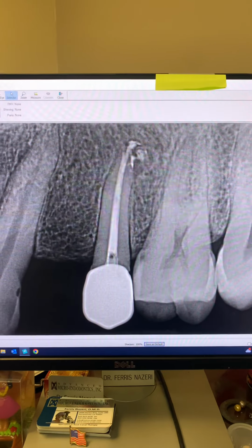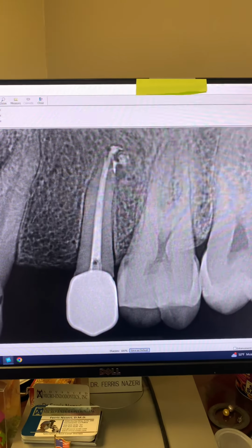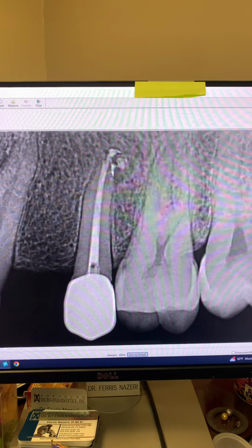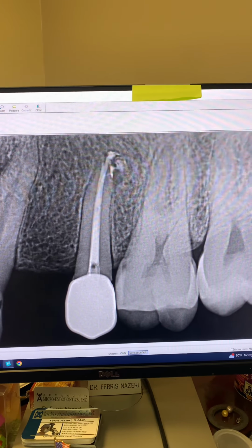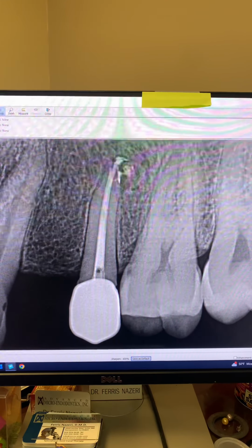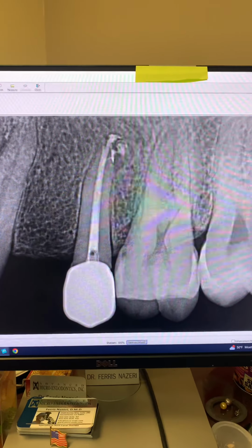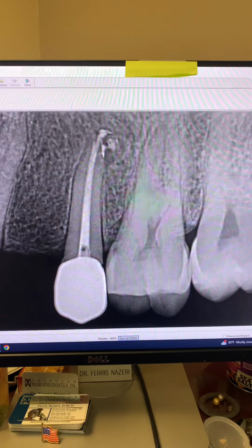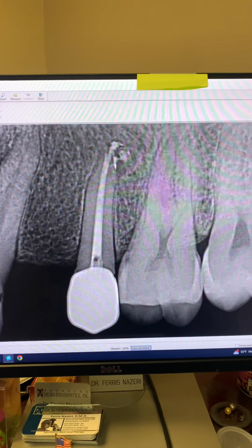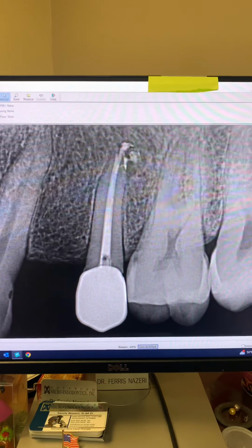As I said, chloroform to remove the gutta percha and hand files. Then one rinse with isopropyl alcohol. Isopropyl alcohol, I want to call it coagulation. It coagulates the gutta percha and chloroform mixture and turns them into clumps, and then you can irrigate them out or brush the canal with your files and remove the clumped up mixture of gutta percha and chloroform. And then I switched to 6% sodium hypochlorite.